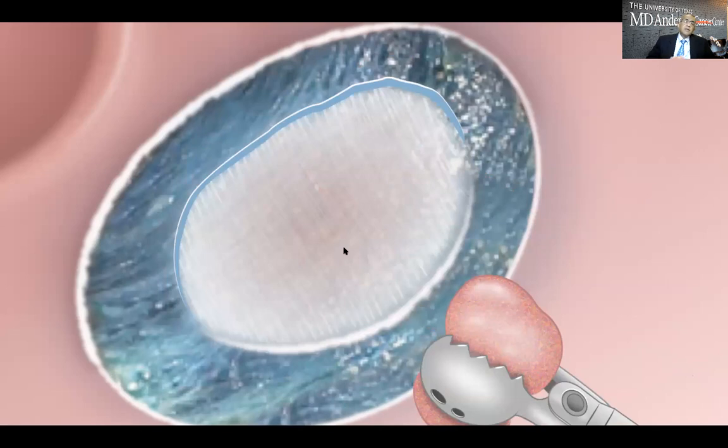And I've used this technique quite routinely. I have to say that I'm able to manage even a centimeter large tethered area without much recurrence. I'm surprised with that outcome.